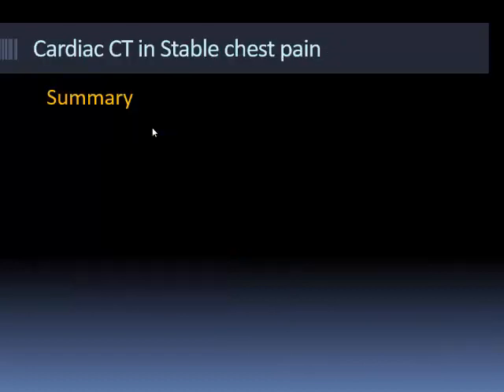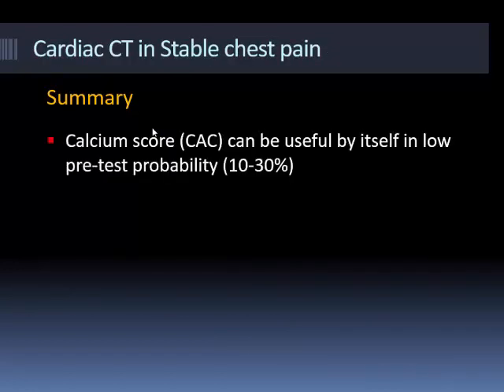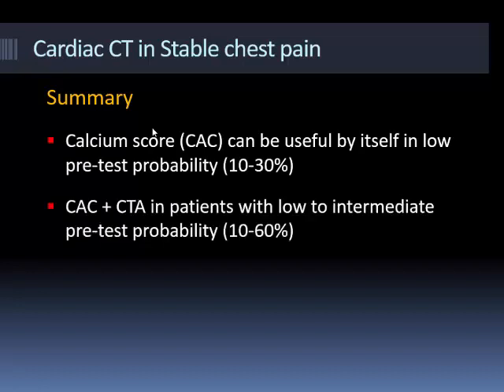Okay, so in summary, using CT in stable chest pain, you can use the calcium score, and you can even use it by itself, as you'll hear later on. I don't know, did you do the calcium score talk yesterday? Yeah. Okay, so you know about that already.